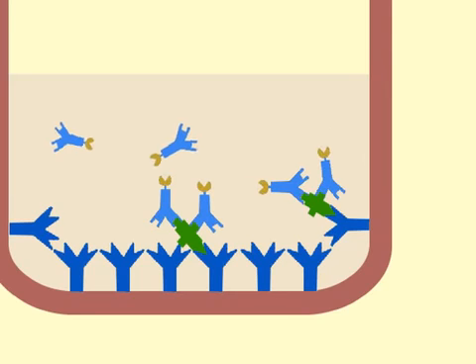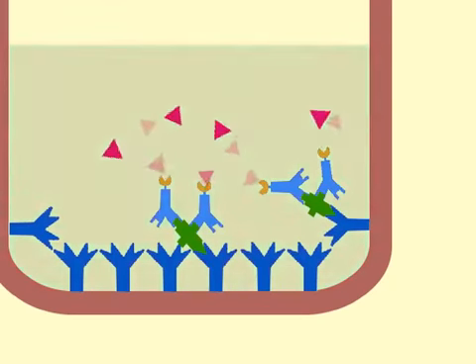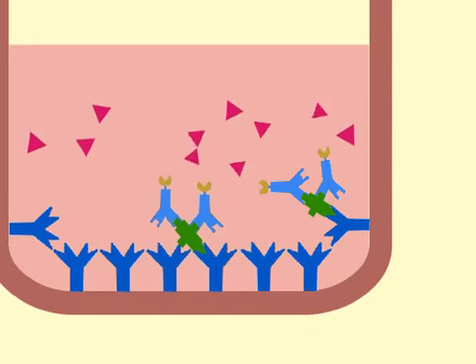the assay. The wells are washed again to remove any unbound antibodies, and in the final step, a solution of a chromogenic enzyme substrate is added. The interaction of the substrate and the captured enzyme generates visible color in the solution.